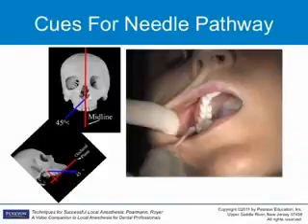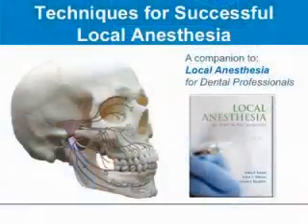Local anesthesia can be a challenging aspect of dentistry. This DVD is an excellent resource when learning or reviewing local anesthesia techniques. It provides clear and concise instructions and information for the comfortable and safe delivery of dental local anesthesia.